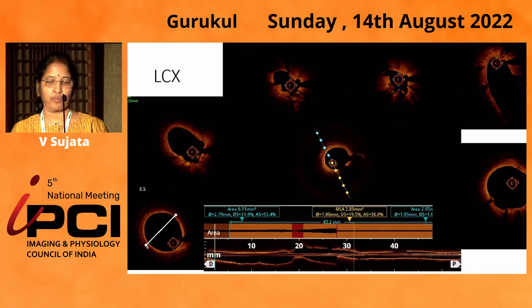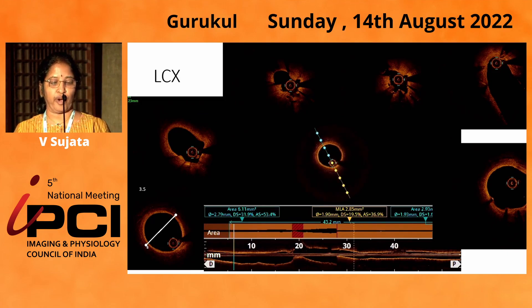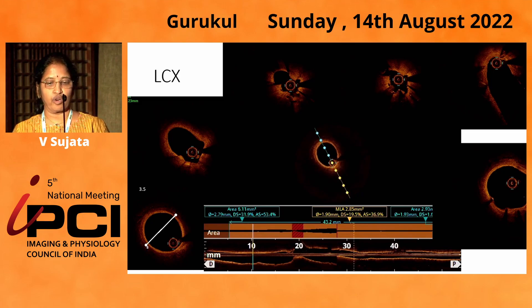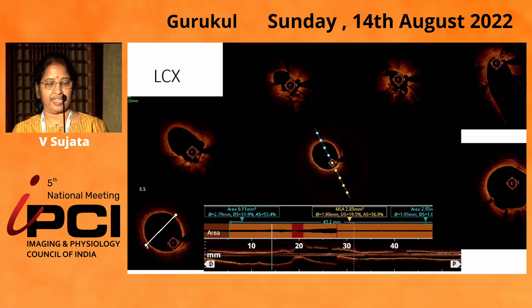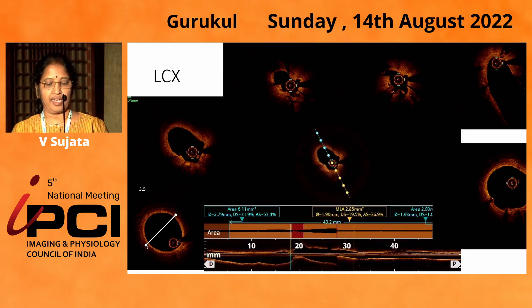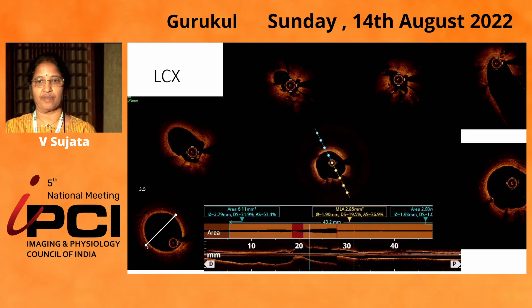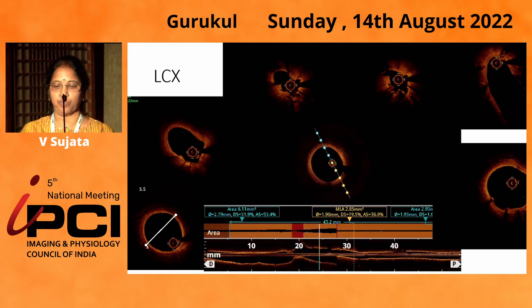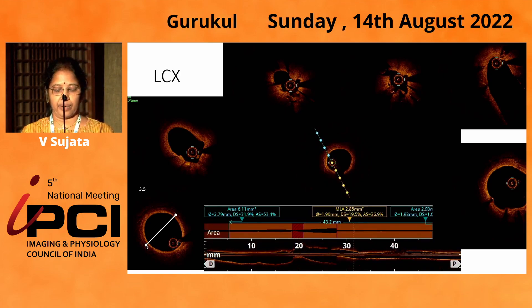We then did a pullback from the circumflex. You can see the distal circumflex is 3.5 mm. As we come proximally, there is a focal stenosis of the circumflex. You can see a crumpled appearance of the circumflex ostium, suggesting struts were across the circumflex — and as Dr. Rowney-Matthew has shown, there can be proliferation and tissue formation on the struts.